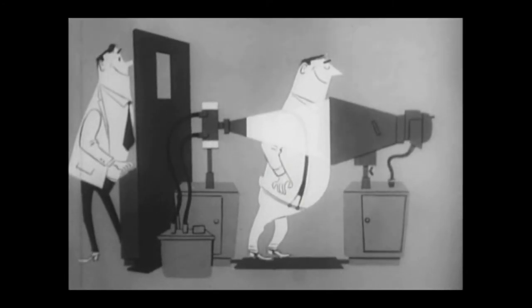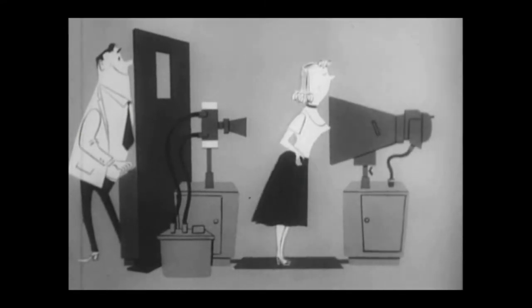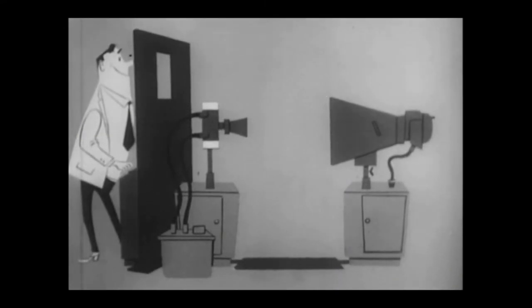Yes, a photofluorographic unit can be a safe place to work. To be safe, you need follow only a few simple safety rules.